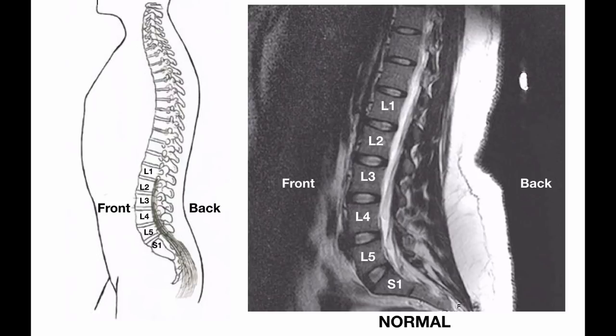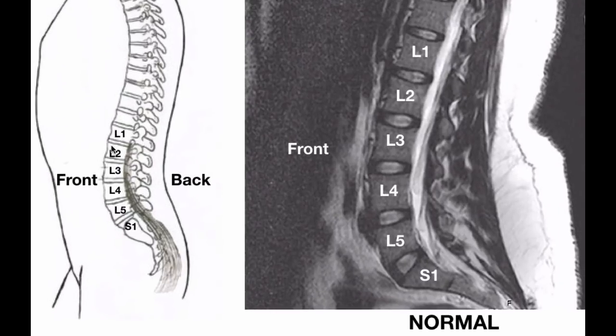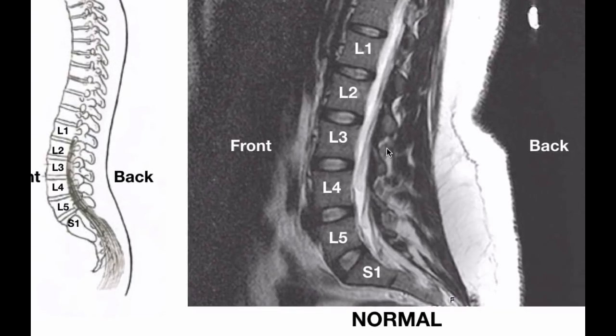So if you look at the picture on the left here, this is for reference only. We're looking at a picture that's looking sideways, looking to the left, and we have 5 vertebrae in the low back here where I labeled L1, L2, L3, L4, and L5. S1 would be the sacrum, which is basically the base of the spine. Here we have the front of the body labeled front and the back of the body labeled back. So now we're going to look on the right side here, and this is what the MRI will show as the spine. Again, we have the front here, the back here, and then we have each vertebra labeled L1, 2, 3, 4, 5, and S1.